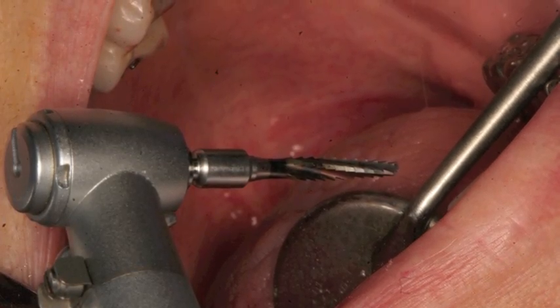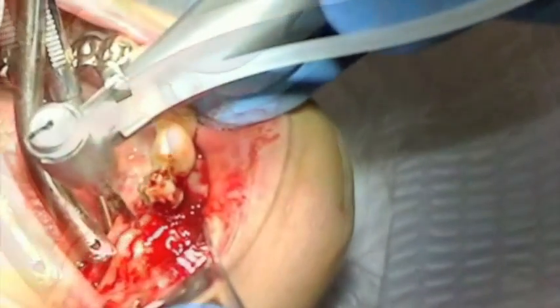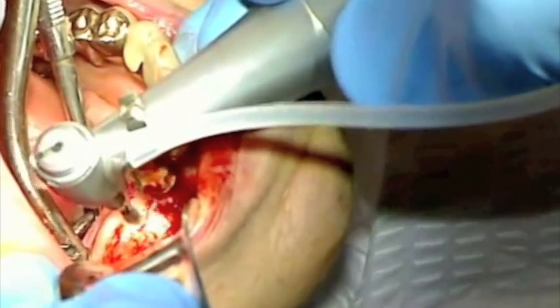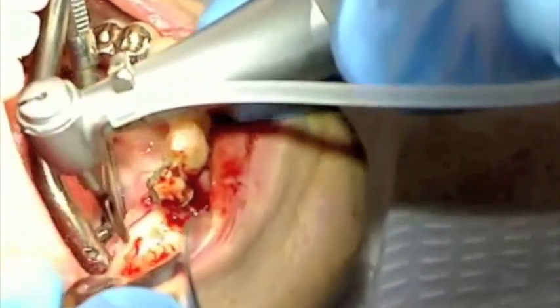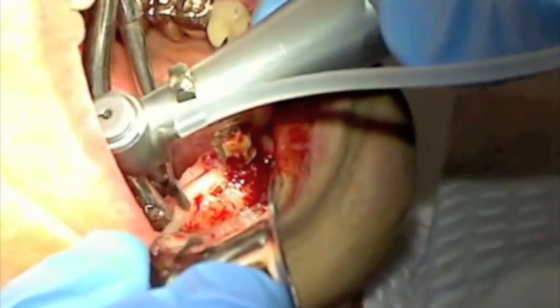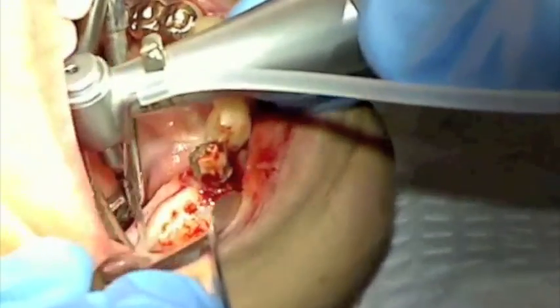Each osteotomy is initiated with a pilot drill. Orienting yourself with the pilot drill in terms of the position of the lingual concavity will prevent perforation of the lingual concavity during pilot hole preparation. At 600 RPMs, we are very careful to stop the pilot drill at 13 millimeters in osteotomy number one. Osteotomies number two, three, and four will be stopped at eight millimeters in length.